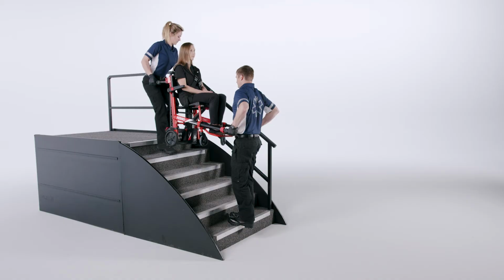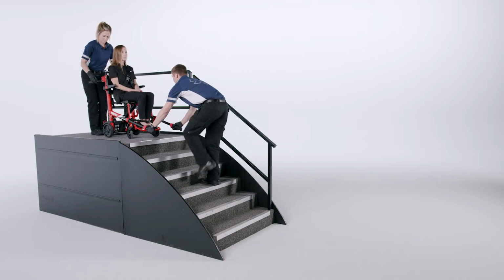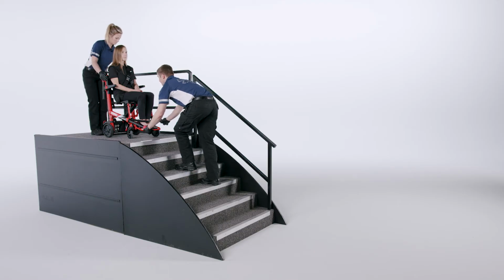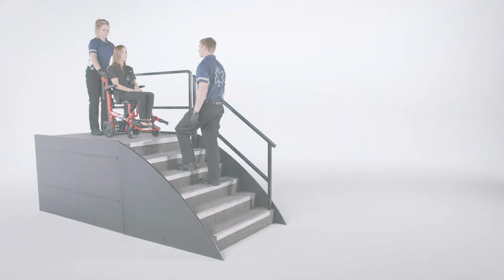At the top of the stairs, set the wheels of the chair down on the floor and roll the chair backwards until the front wheels are securely on the floor. Retract the lift handles and adjust the lift bar.